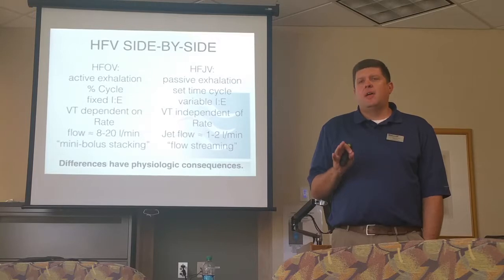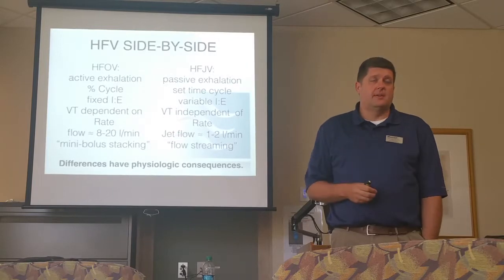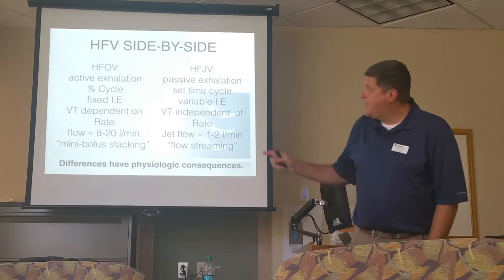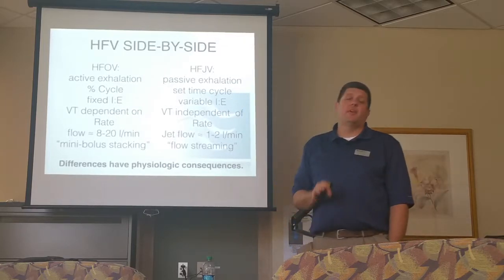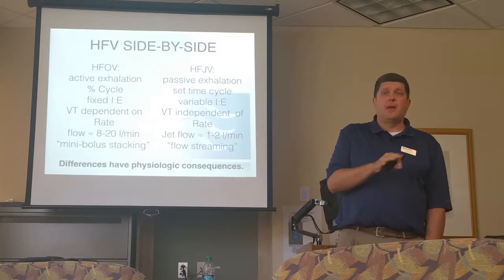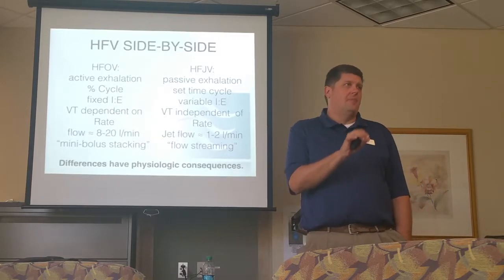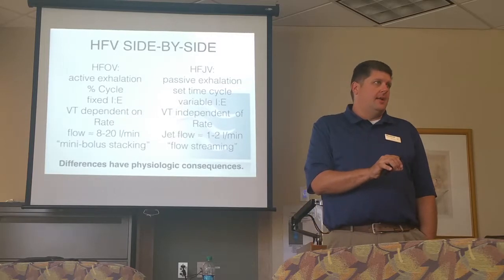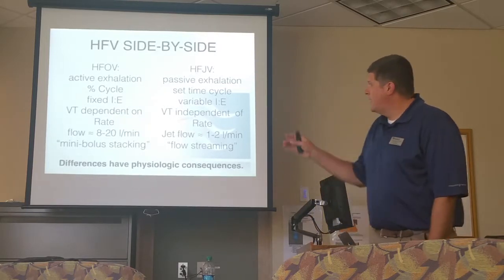They have long expiratory pulmonary time constants due to their lack of elastic recoil. And we need to allow sufficient exhalation time. With it being a time cycle machine, that also means now that my tidal volume delivery is independent of my rate. It doesn't matter what rate I'm on. My tidal volume delivery is dependent on my delta P and my inspiratory time. Okay, so they're a little bit different.